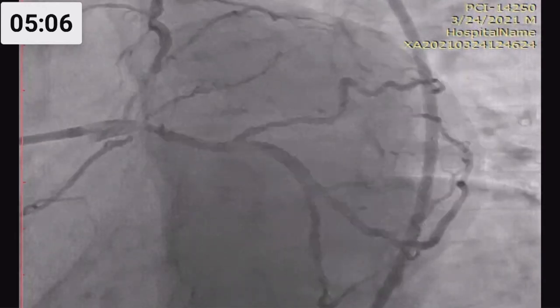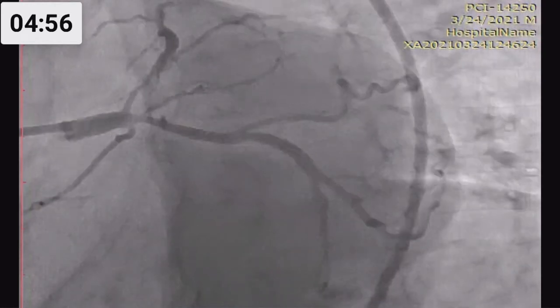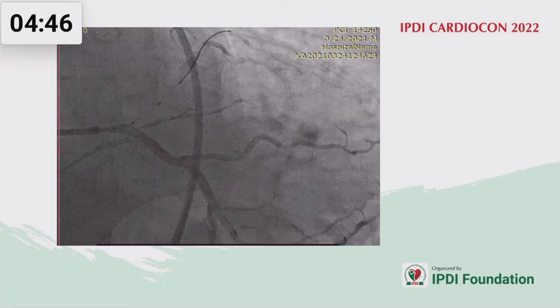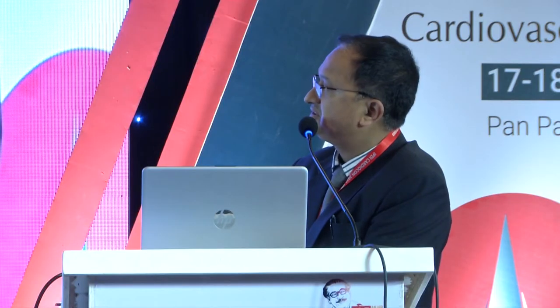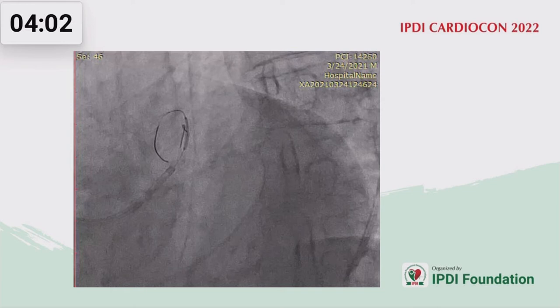This is another coronary case. The patient had angina on exercise. We discussed with the patient, who wanted angioplasty. So we decided on a two-stent strategy — simple TAP stenting. My aim is not to show the technique of stenting but to show the complications. We put a stent from the left main to the circumflex and did TAP stenting. After finishing the case, you can see one extra structure — the distal wire has fractured. We tried to snare that part, but it was not coming out. The risk was that, because this was an old wire, if you try to snare it, the wire might fragment further and go distally.